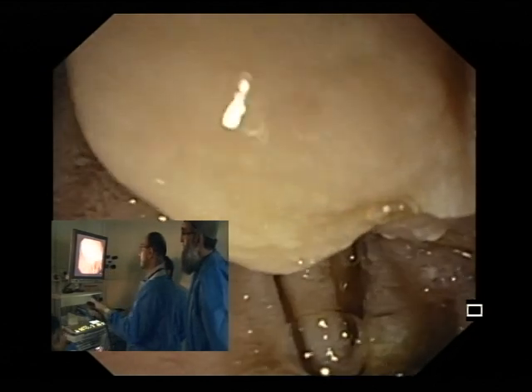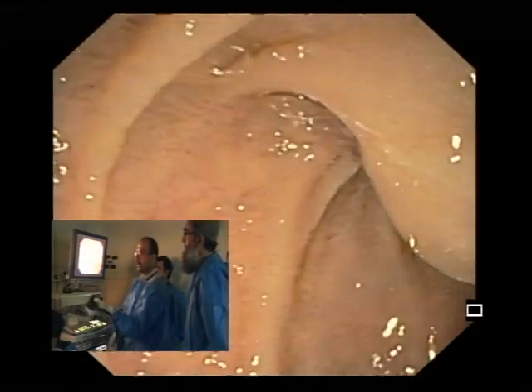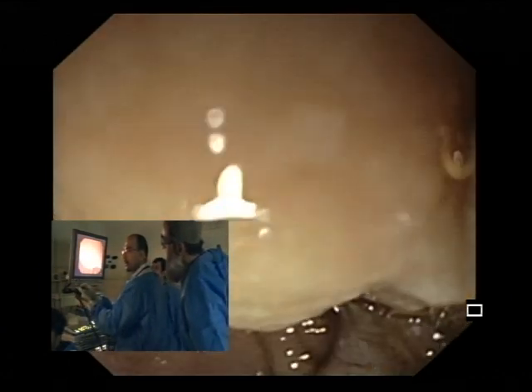I think their anatomy is deformed because of the tumor. So that's why you were having a hard time. He's probably developing duodenal outlet obstruction, but it's hard to say. So we're not necessarily below the ampullary orifice. I think at best our ultrasound scope will be at the ampullary orifice. So right here, I'm going to thumb down again to get apposition against the ampulla.